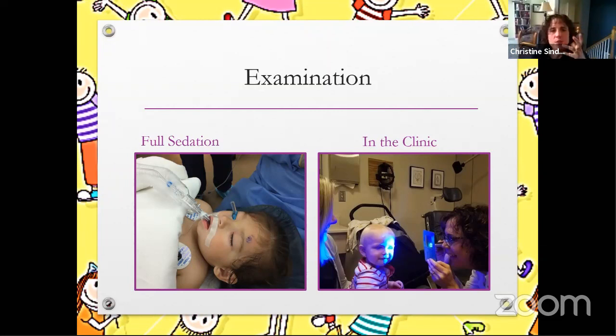Taking an impression, you then have their eyeball that you can work with in virtual space. So any of the symblepharon or any of that, you can work around in 3D space. You can't create a 3D contact lens like that unless you have some type of ocular surface data. So if you have a scan of the eye, Oculus Eaglet will do 3D scans of the eye, or an impression of the eye, something like that. Or you have to do a soft lens.